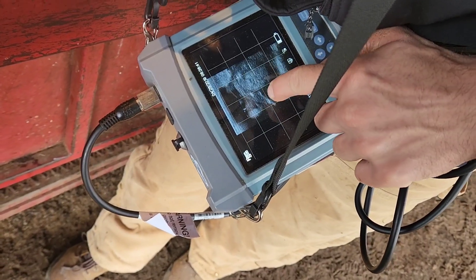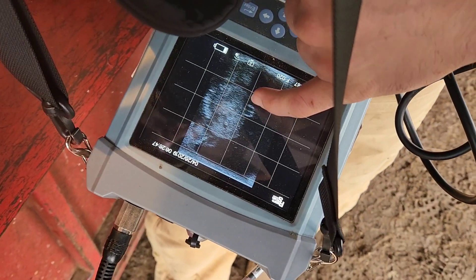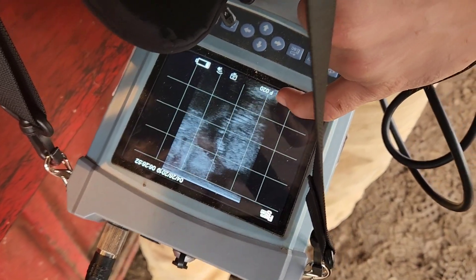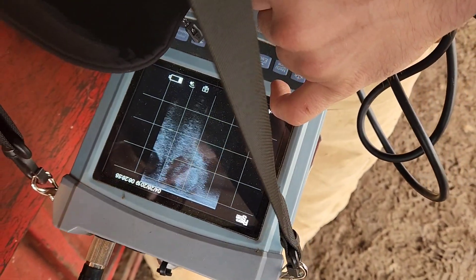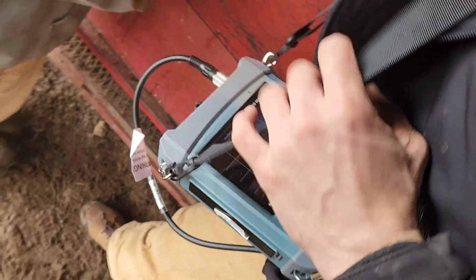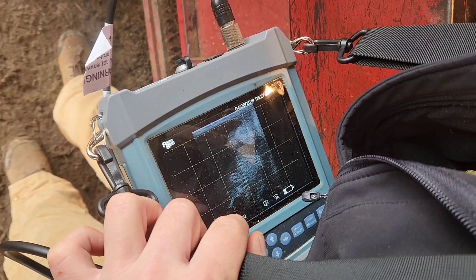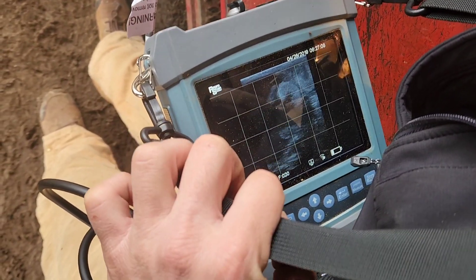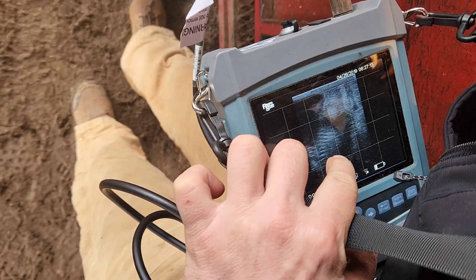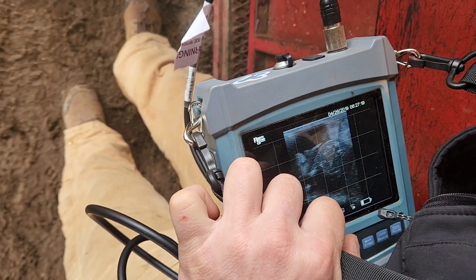You can see that's part of a leg right there, head is up in there, the umbilicus right here — those three lines — and ribs right there. You can see your front leg right there, and all these rib lines, so that's what we're seeing. And then hips right there — you can see that's just the hips.